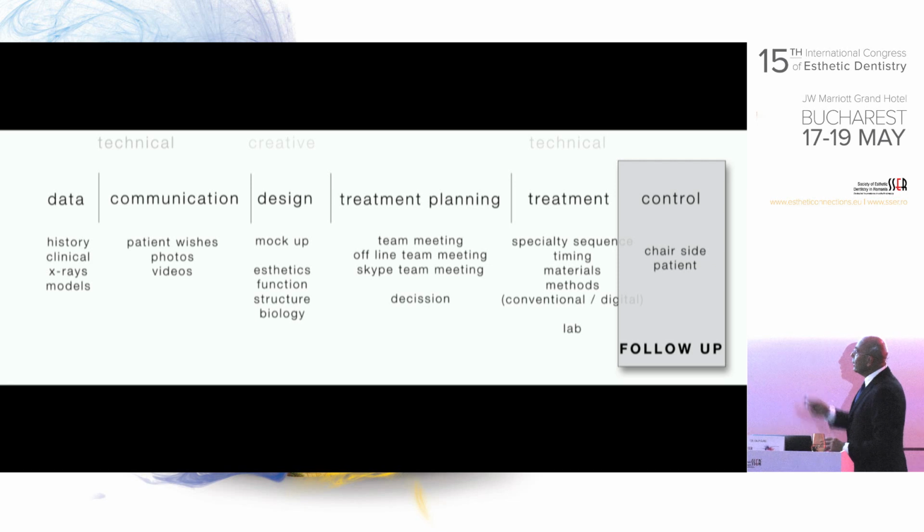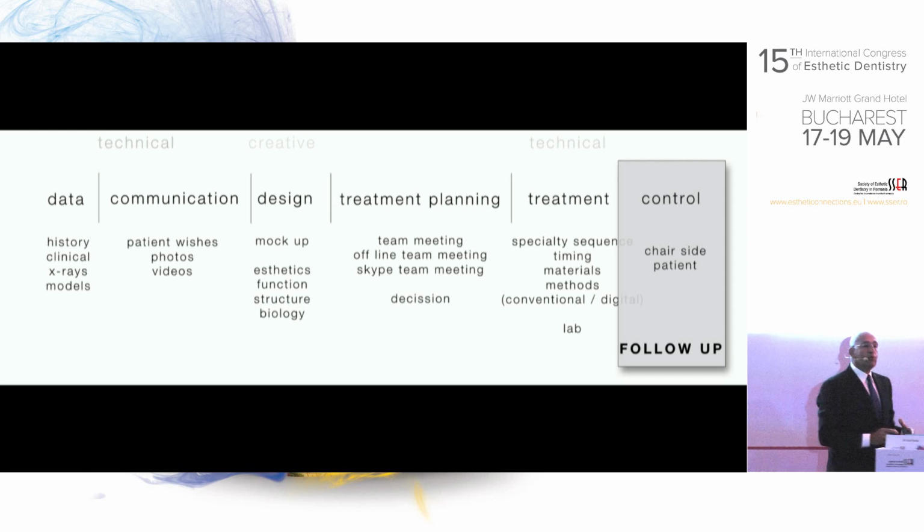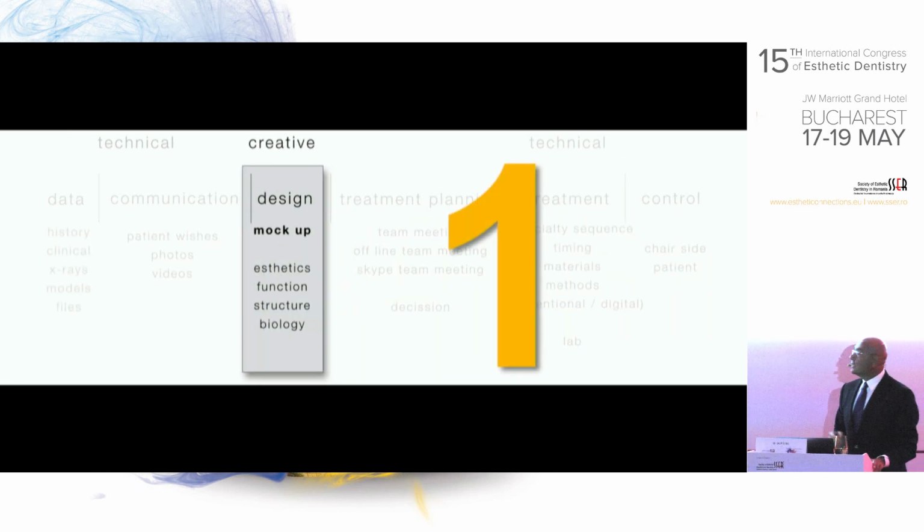In this whole workflow, what will make you different from other dentists is this one in the middle. It is the design part, the most creative part, the mock-up that you deliver to the patient. Because this is your first physical contact with the patient. They're asking for a better smile, and they have no idea. Even if you explain it for hours and hours, they will not get it. Maybe a few words, but not the whole thing.